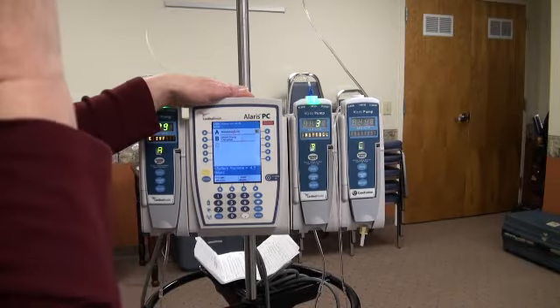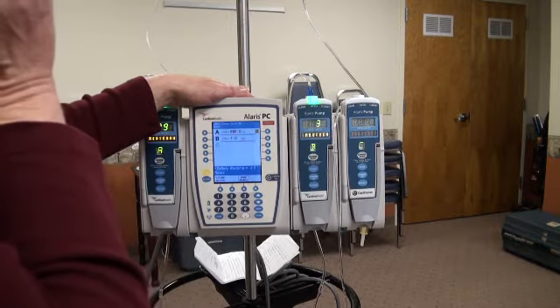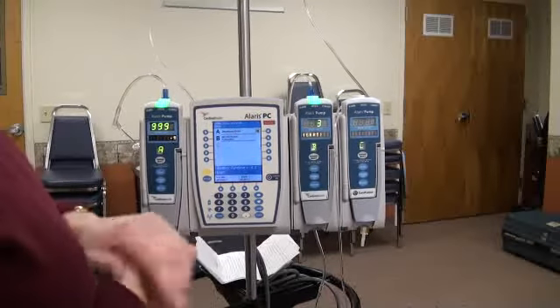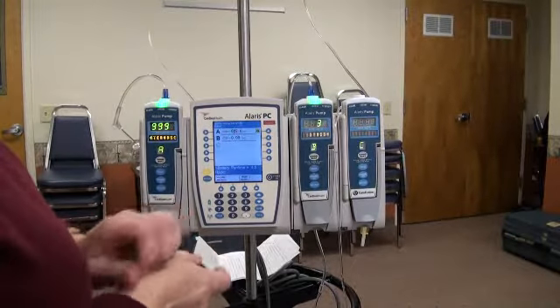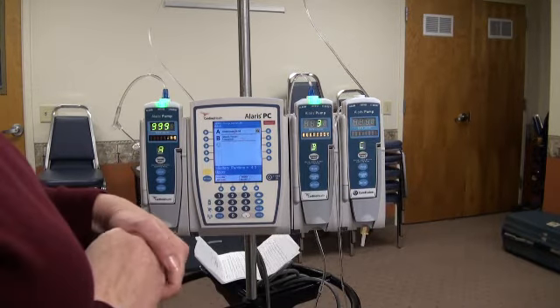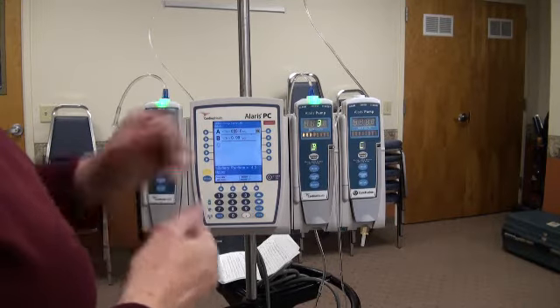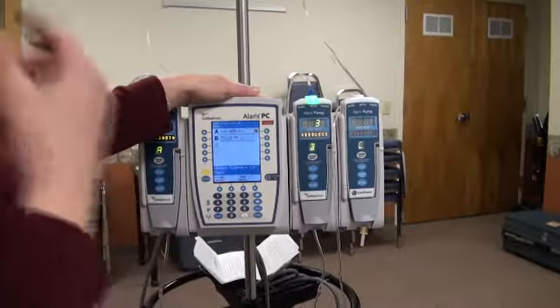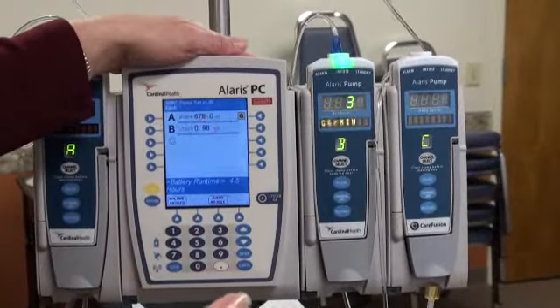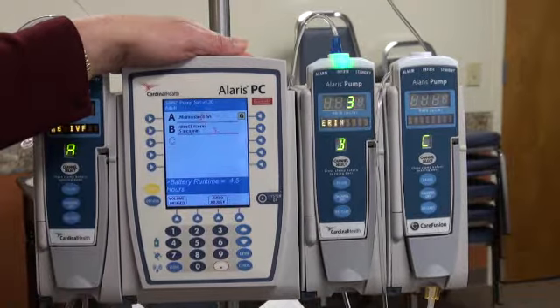Alrighty, I had a good question here on, say you're transporting a patient, and we're just going to use nitro as an example. It's running at 3 mil an hour, which is 5 mics a minute. Say the nurses, which a lot of hospitals do, set it so that your IV pump alarms every half hour. That's just a reminder for them to go in, check the patient, check the IV fluids, check their IV site, make sure it's good.